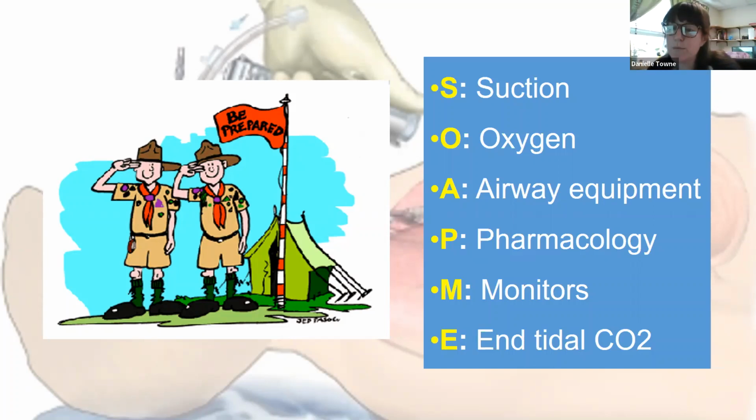Make sure your SpO2 probe's working, and there's somebody in the room that's going to continuously monitor the SpO2 so that you can alert the intubator if the O2 sats fall too low during the attempt. And usually we say too low is about 90%, but we're going to talk about that a little bit more with the pre-oxygenation phase. And that's really a number that should be determined by the team in that moment based on that patient.